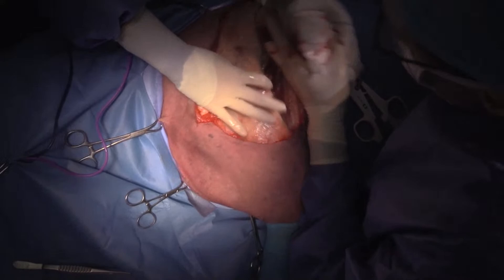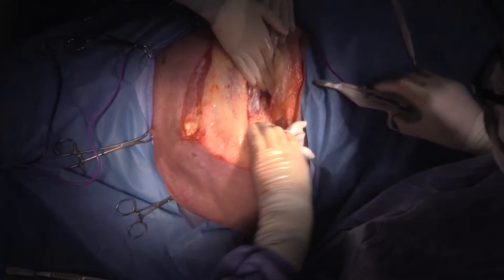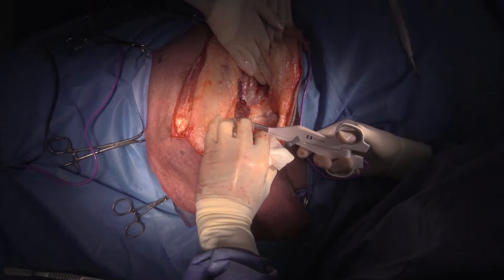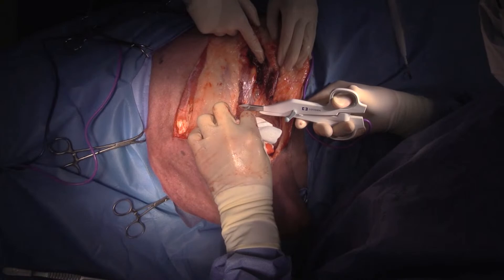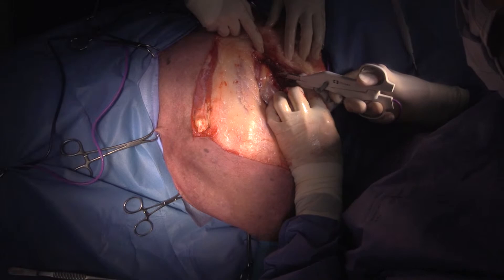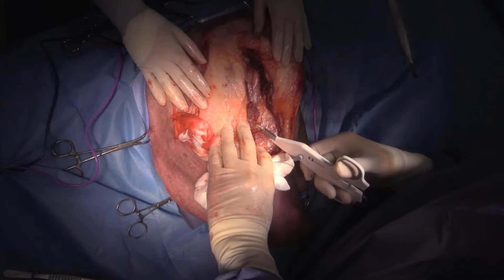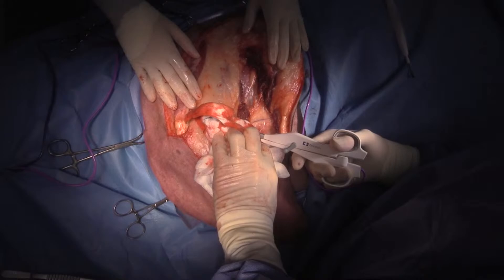So that's the last of the latissimus dorsi muscle. This one's going to be a bit more challenging than some because the dog hasn't been particularly lame, so we don't have a lot of muscle atrophy. I may not be able to stick to my one lap sponge goal.